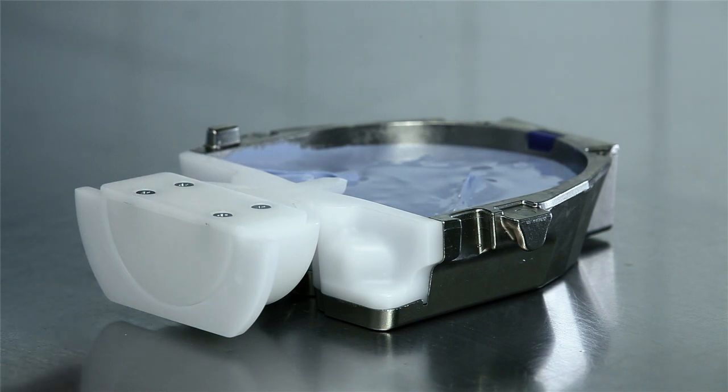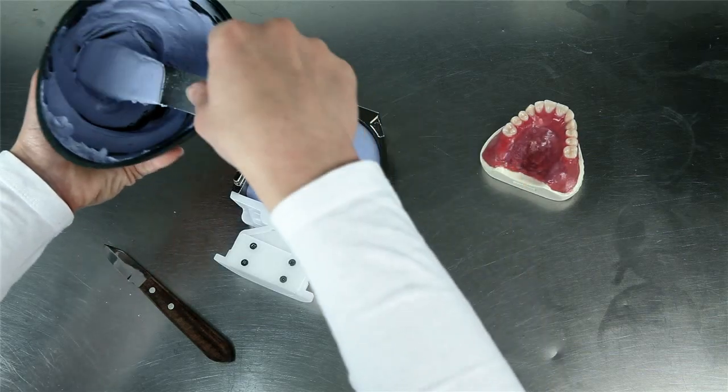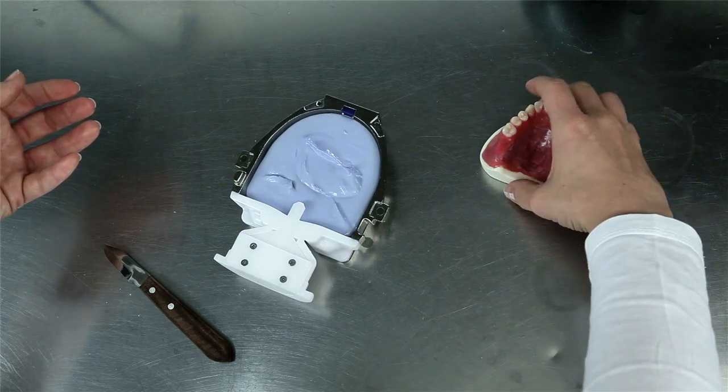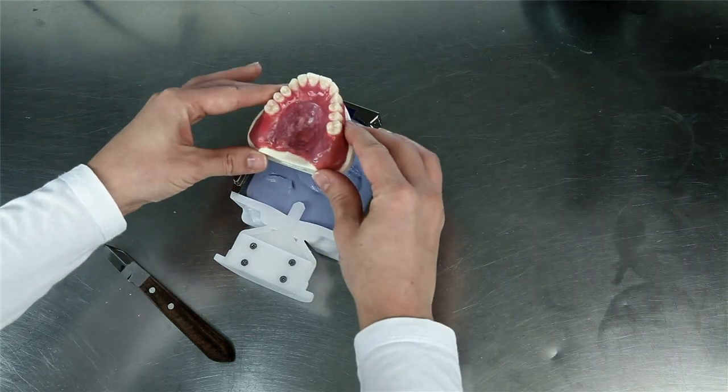You can now invest the model in stone. Use a class 3 hard stone for this. Make sure to place the model in the center of the flask.